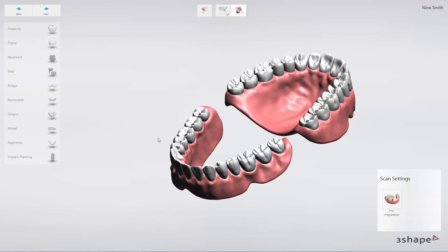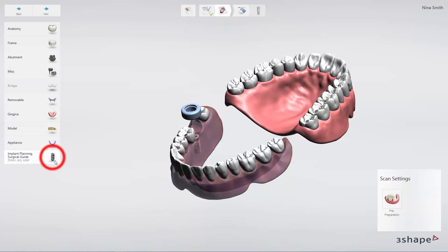To create an edentulous case in the 3D order form, simply mark one tooth and then choose Edentulous Implant Planning and Surgical Guide for the Mandible.